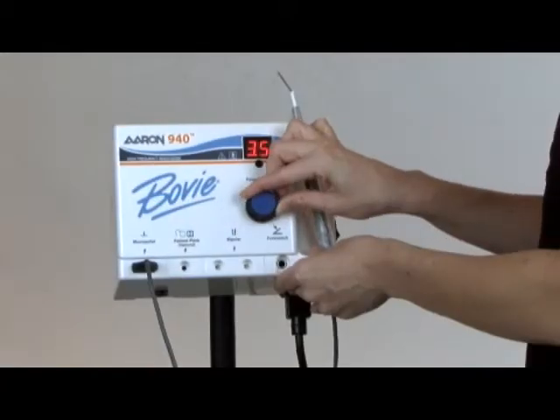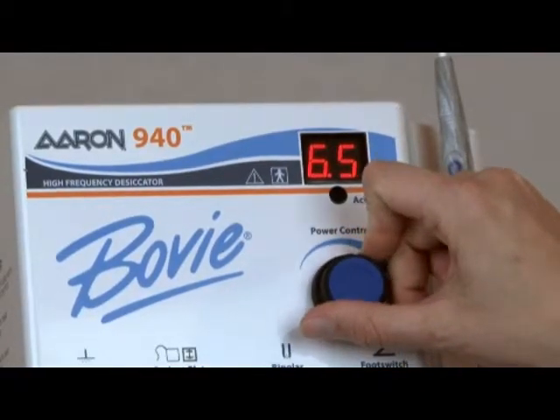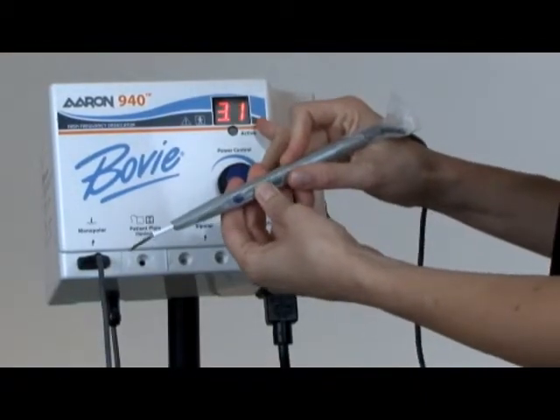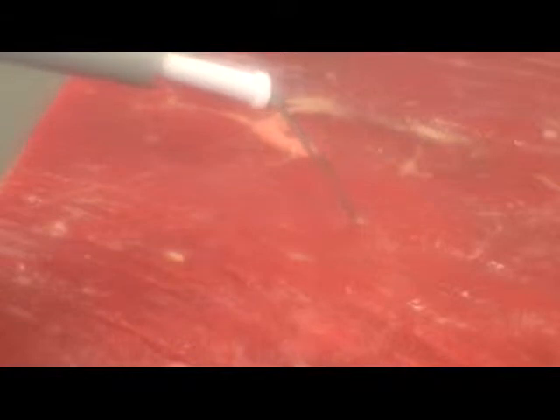It is important to always begin with a low power setting. When you need to increase the power output, rotate the power dial clockwise or push the up power button on the handpiece. The best way to get comfortable with the Aaron 940 is to practice with a raw, lean flank steak. This allows you to get comfortable with the various power settings and the different effects of each tip.